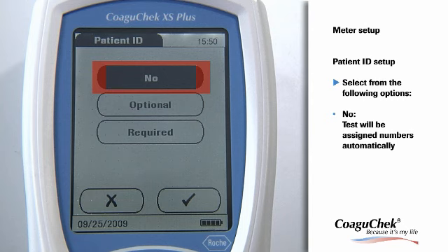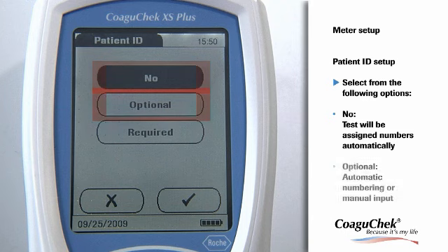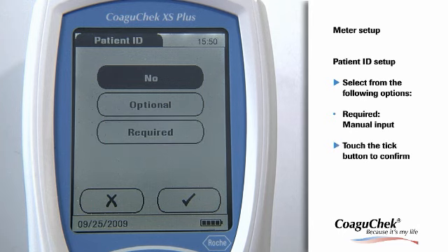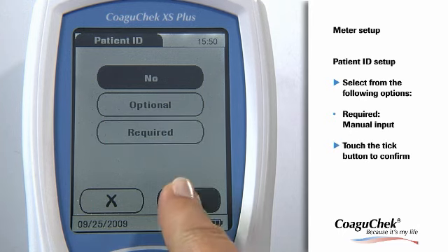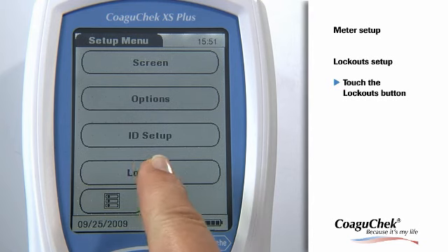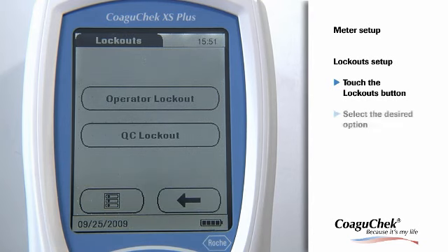The Patient function enables you to record test results with unique patient IDs. If you select No, tests will be assigned numbers automatically and no further entries are necessary. If you select Optional, you can choose between automatic numbering and manual input. If you select Required, you need to enter patient IDs by manual input. Touch the Tick button to confirm. The Lockout menu contains options for quality control that prompt the operator to perform a mandatory quality control test at specified intervals. For more information, please refer to the manual.